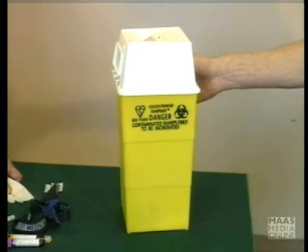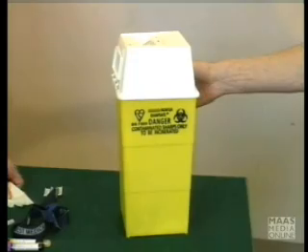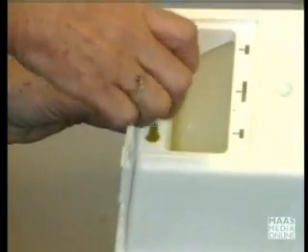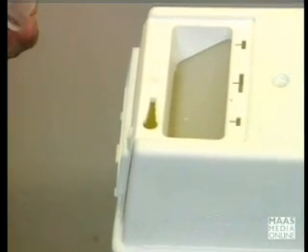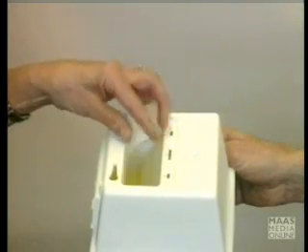Having completed the venepuncture, it is important to dispose of the needle and the vacutainer holder if it is contaminated. At the top of the sharps box there is a slotted area which you slide the needle into and just turn it round until it comes off and drops down into the container itself, so that it is not being exposed to any fingers in the process. If the needle holder is contaminated, you should also dispose of that as well.